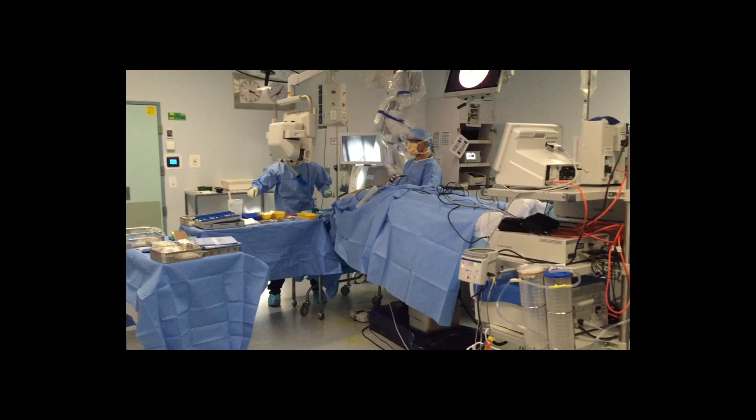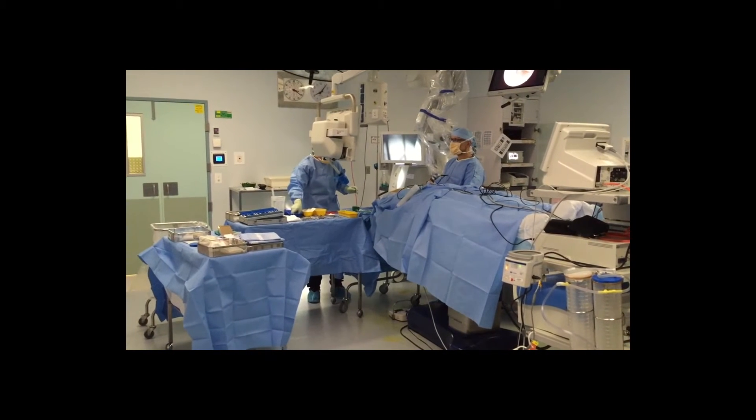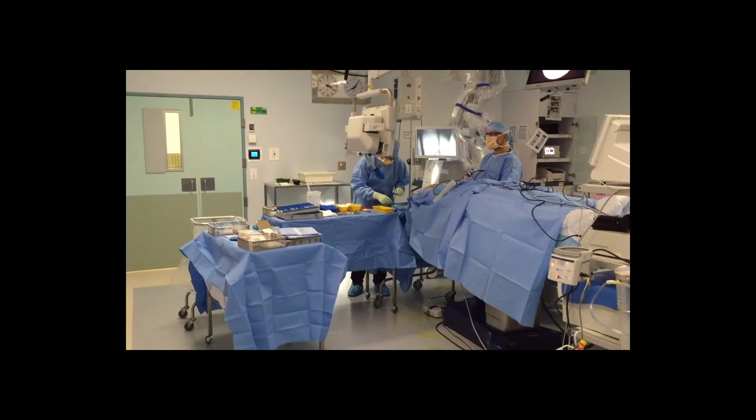Here I'll demonstrate a typical left ear operating room setup for endoscopic ear surgery, with the surgeon standing and the scrub nurse to the right hand side. The operating room lights are usually dimmed, but for this video we kept them up.